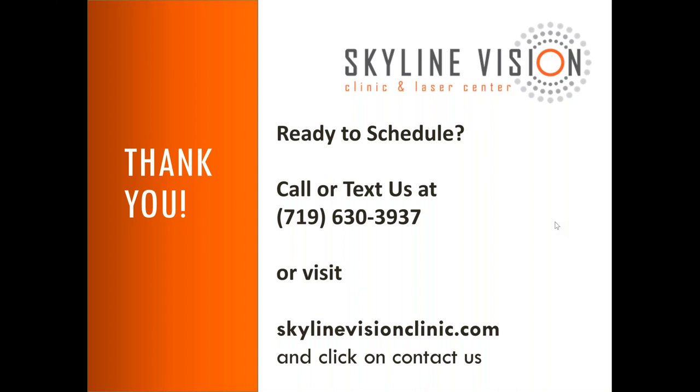It's particularly helpful for patients who've had prior refractive surgery. If you've had LASIK surgery or RK surgery or any other sort of corneal refractive procedure, the standard measurements of trying to figure out your implant power are very difficult. And in fact, it's for the most part an educated guess. The Aura provides us a little bit more of an objective way to figure out which implant to put in, with more confidence to reach your goal.